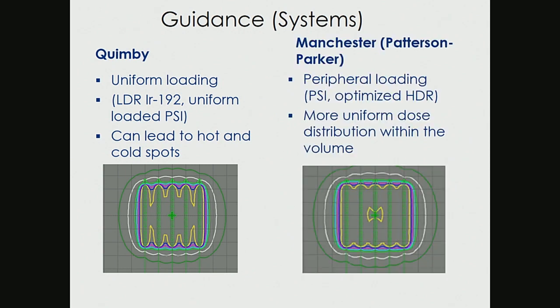I would say a more modern practice is the Manchester or Patterson-Parker system. This is what we do now. We've been doing it for peripherally loaded prostate seed implants and optimized HDR implants. You're going to hear a lot about optimization later on this morning. Those tend to load the activity towards the periphery of the treated volume, and that leads to a more uniform dose distribution within that volume.